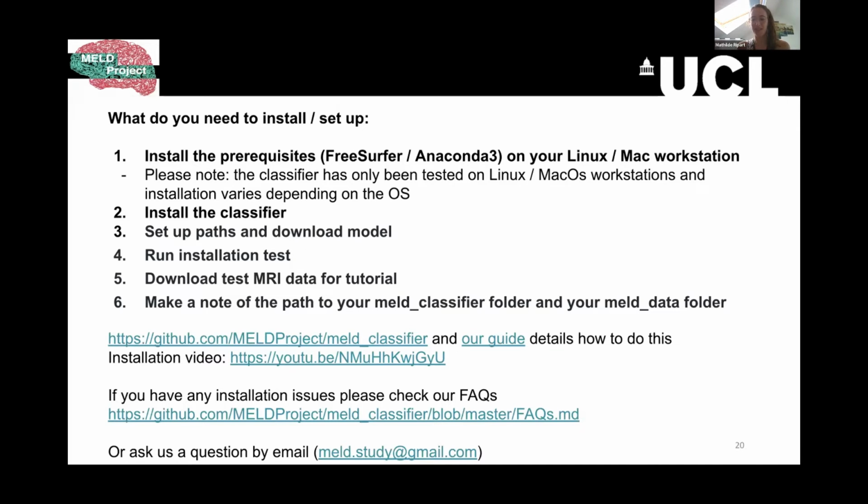So just be careful not to use the wrong version, because if, for example, you're doing the harmonization with one version of FreeSurfer, and then you're predicting some patients using another version of FreeSurfer, we know that there is some variability between FreeSurfer versions. That's why we said that if you have one version for the harmonization, you should stick with this version for the prediction as well. But as long as you're aware of it, it should work fine. Yeah, fair. Thank you for helping with this.